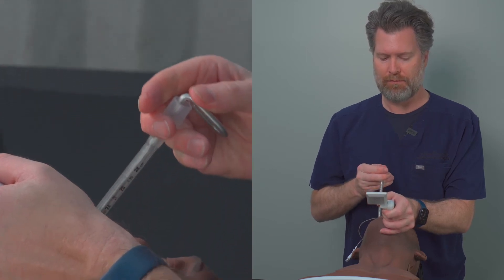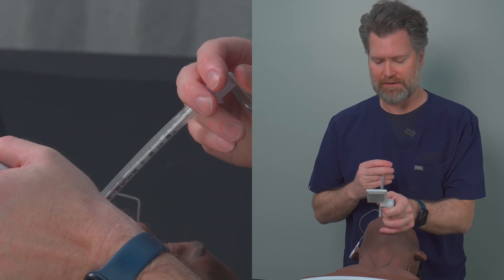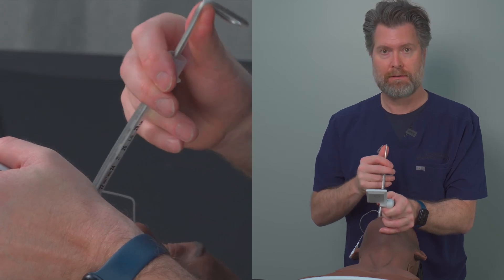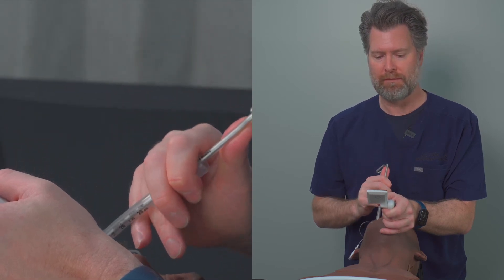So you can see that movement again. I'm at the trachea, I'm at the glottic opening, I'm hitting the anterior trachea rings, I'm getting resistance. Now I just lift up with my thumb — that softens the tube a little more — and I'm able to glide that tube safely into the trachea with minimal force and minimal resistance.